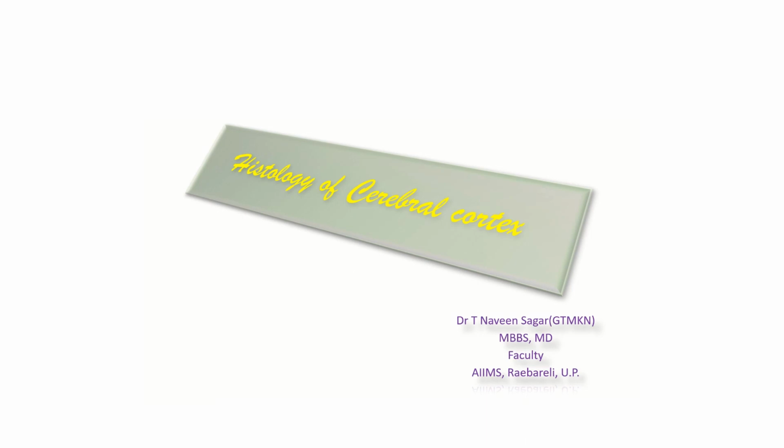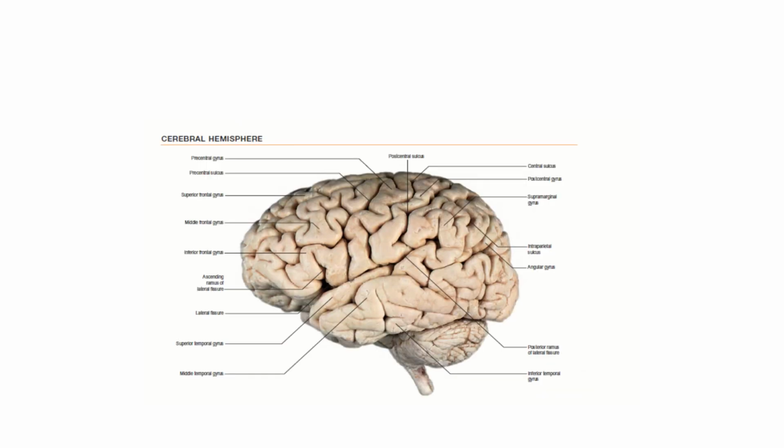Good evening, students. Today we'll be dealing with the histology of cerebral cortex. See, this is the cerebral hemisphere. You can see the cerebral cortex has been thrown into gyri and sulci.